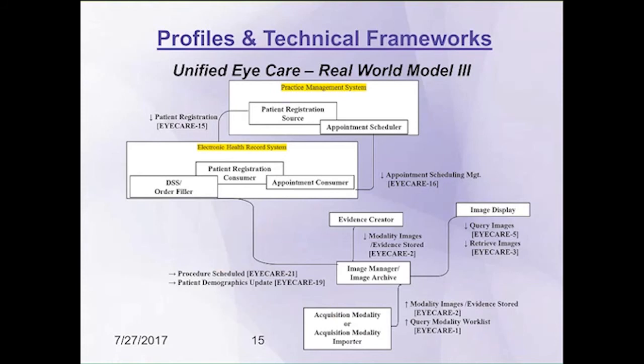And then again, Real World Model 3. The main difference here, of course, was that your EHR does not do DICOM, therefore it uses HL7 only, and your image manager provides your work list.